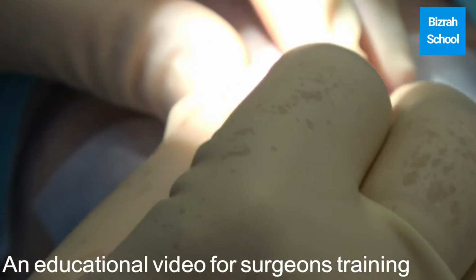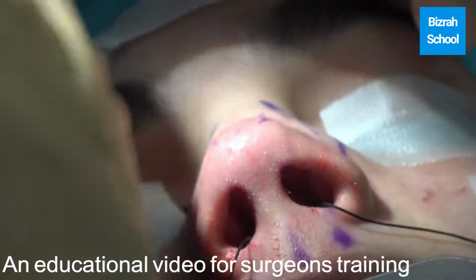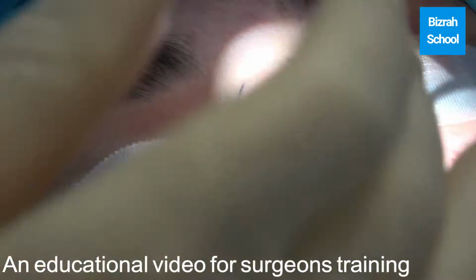So now, having done so, we'll start doing our osteotomy, because the nose is deviated considerably and markedly to the right side, so we need to do mid-lateral first here. Mid-lateral.